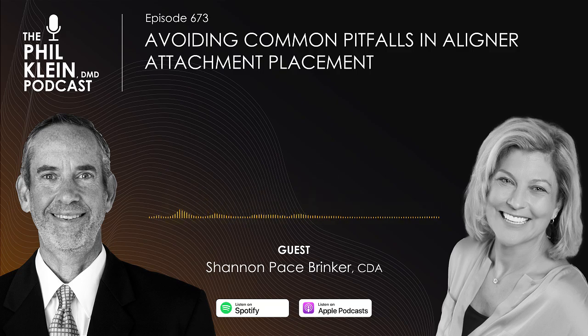So as far as the etch and placement, we want to make sure that we only place the etch at the location of the attachment. In other words, it has to line up with that pocket that's in that template. How do we ensure that we're putting the etchant material just where we want it and we don't over etch haphazardly the enamel around our target zone?